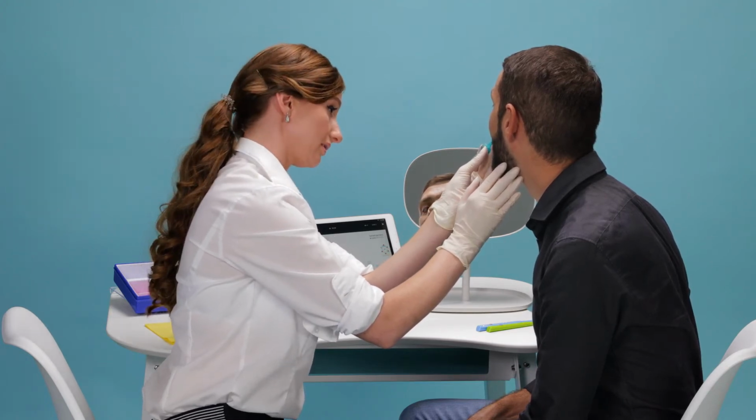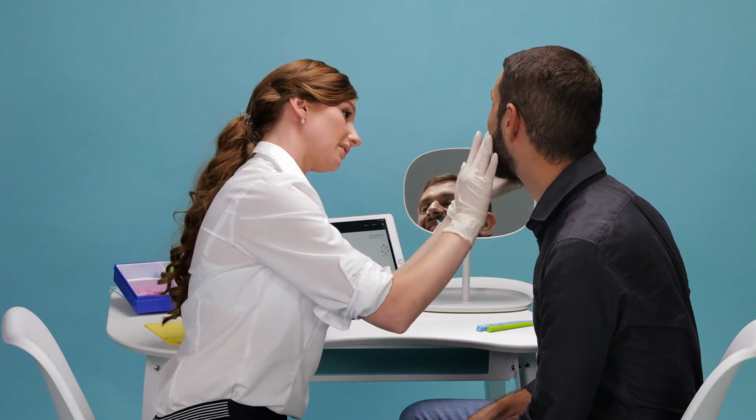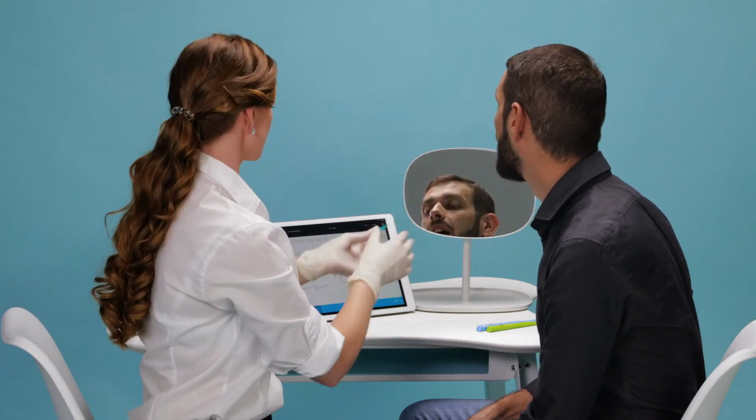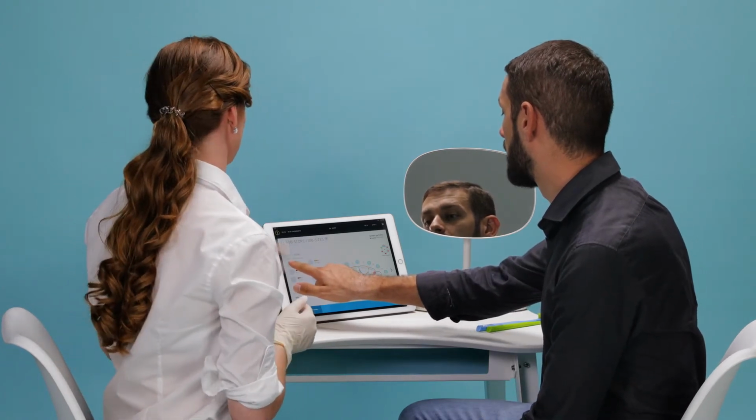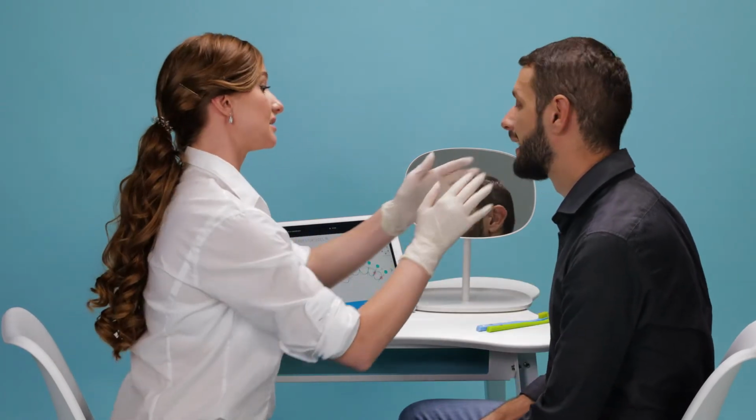He then inputs into his score the turquoise brush for the upper anterior sextant. He holds down the button which automatically infills the whole sextant with that colour brush.